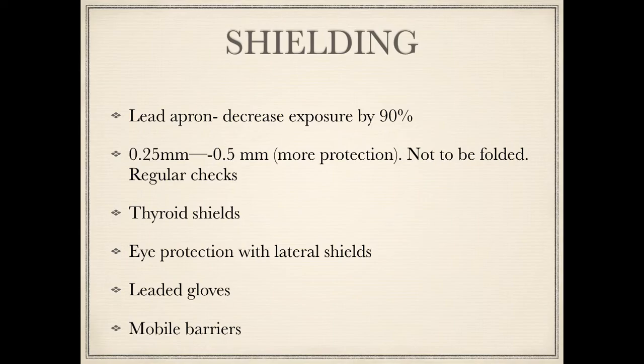Now, moving on to the shielding, lead aprons are something we all use. You must have seen different varieties. You get the jackets and the skirts separately, or you get the one-piece ones. I prefer the separate ones, the jacket and the skirt separately. There are a few advantages which come to my mind. Number one, the whole weight of the lead apron is not hanging on my shoulders and not straining my lower back if I'm using the two-piece ones, because it's divided. Half of the weight is on my waist and half is on my shoulders. So from the mechanical point of view, it is less load on my back.